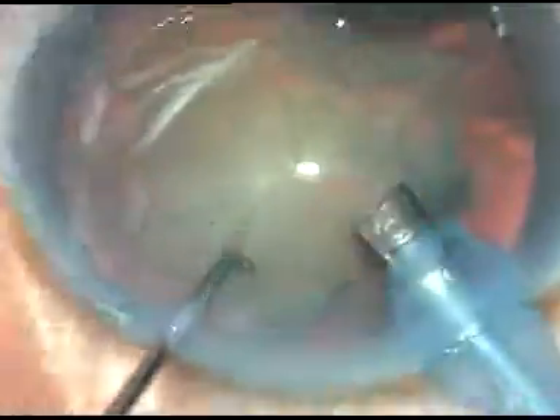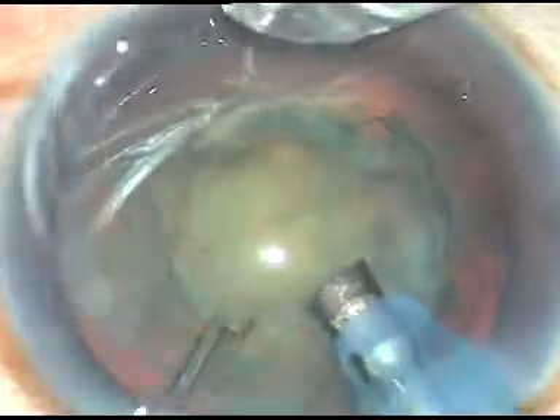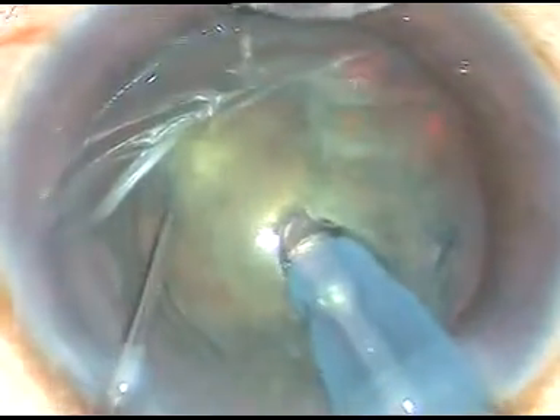Sometimes we struggle a little bit to enter into the eye. In this case, I have gone into the eye with the bevel sideways, then the bevel is now half-in and a little bit of cortical matter has been aspirated. Now, two or three sculpting passes, and then I go a little deep into the nucleus, hold the nucleus firmly, and make a chop.